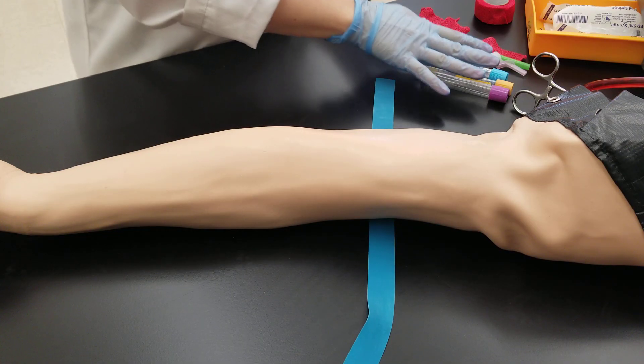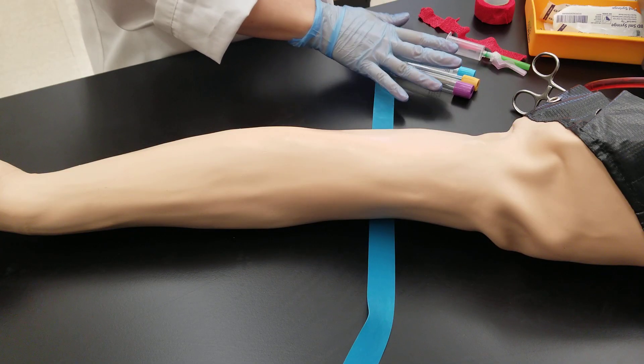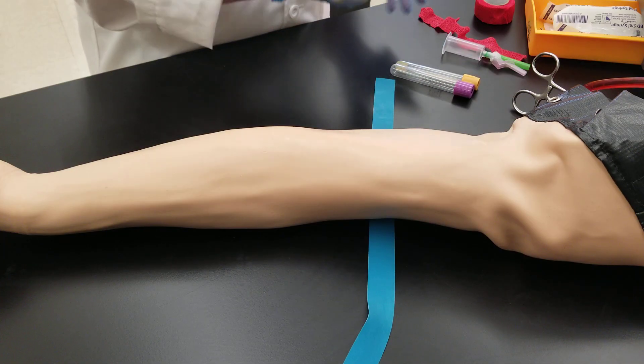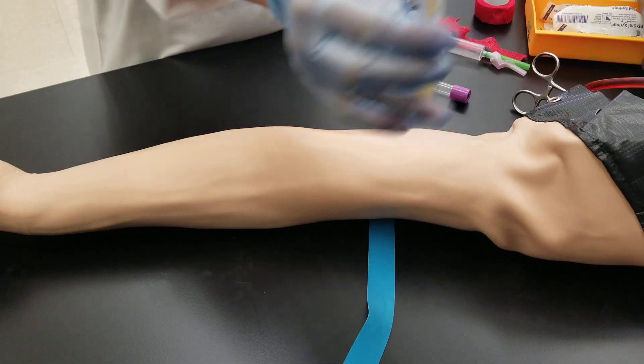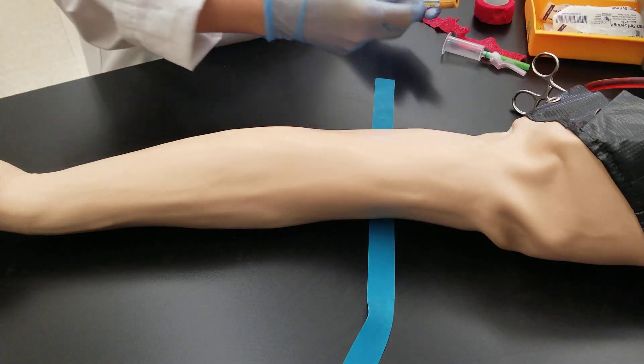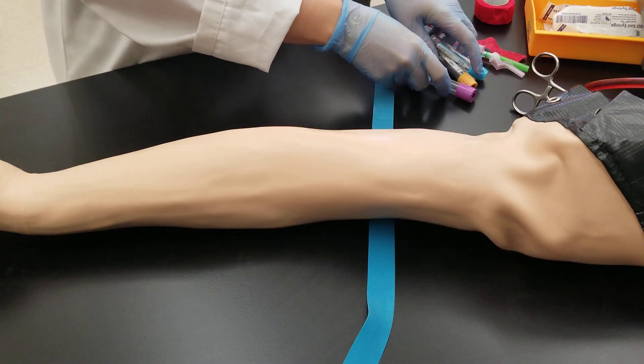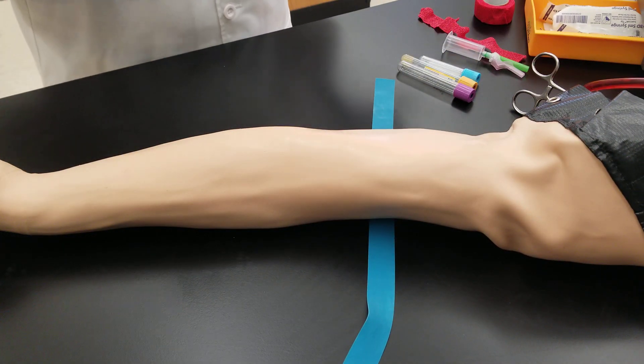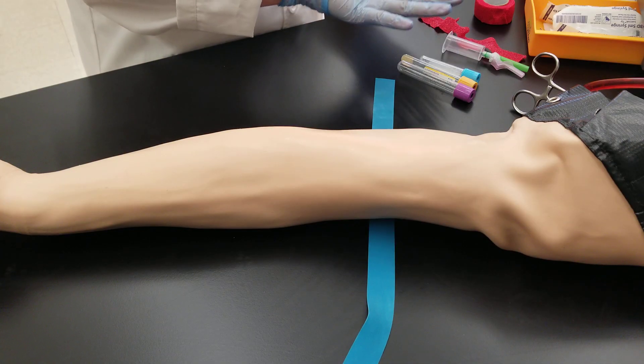I'm going to be treating this patient as if they were a pre-op patient, so that usually involves coagulation studies in a blue top, chemistries in a gold top, and CBC hematologies in your purple top. And that's the correct order too. So I've prepared my equipment.